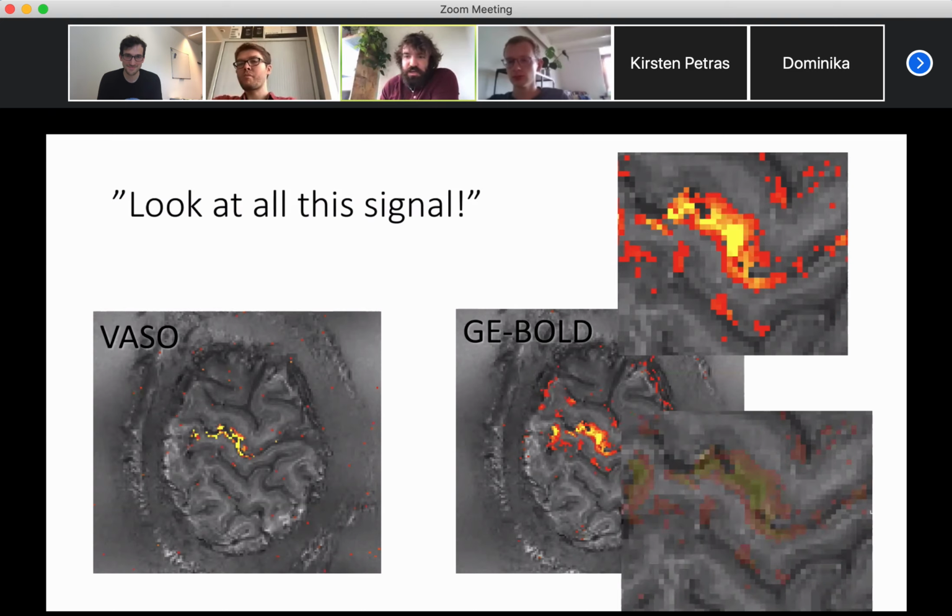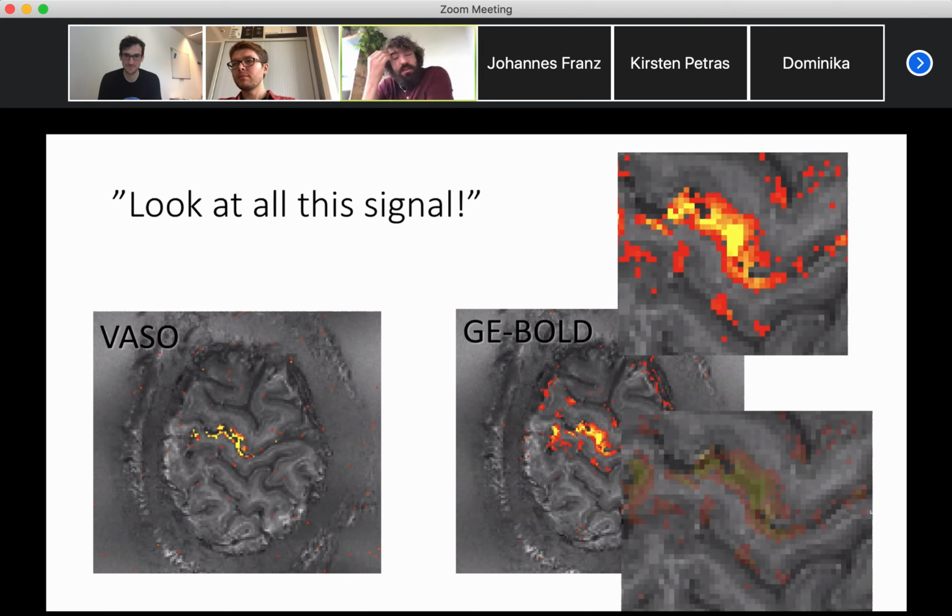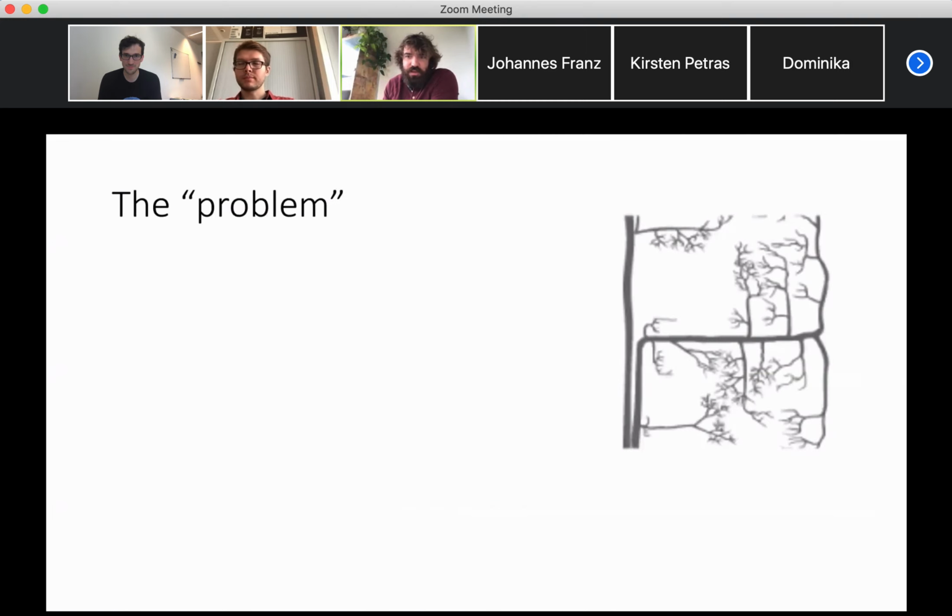We're pretty much done. But if you actually look at your data, which is probably the most important thing, you start to realize there's an issue here. Renzo's talked about this extensively. Not only is it biased towards the superficial layers, it's outside of the gray matter you care about. It's practically out in what appears to be CSF. That's just because of the properties of gradient echo bold. So it's a problem.